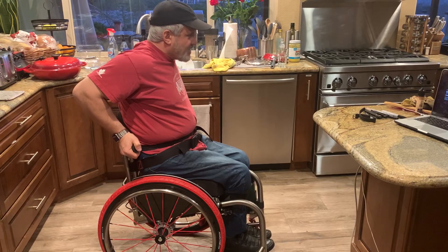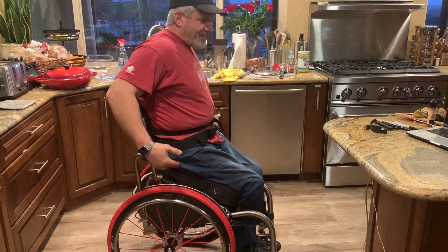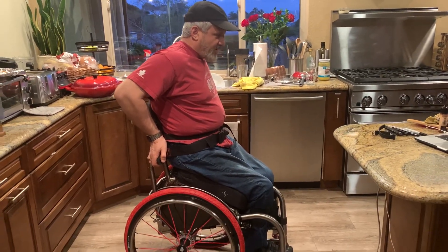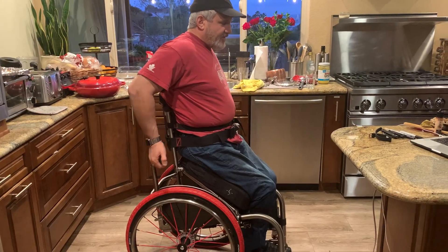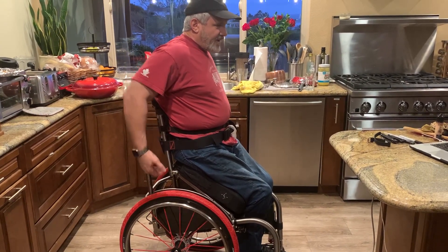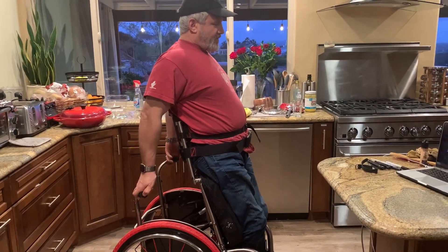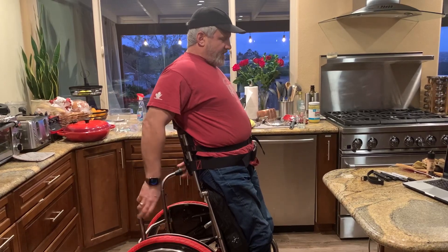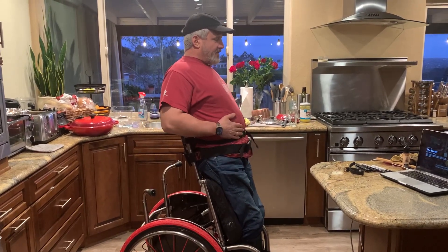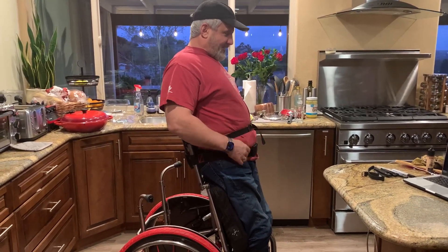Going up — I press these buttons, that releases the lifters. I could sit here because as long as I'm not pressing the buttons, the lifters are locked in place. I have a lot of air out of the lifters — they were pushing with 292 pounds each and I reduced it about four times. I don't even have to lift; I don't want to lift. I want to pull myself back down. I let air out of these lifters four different times.